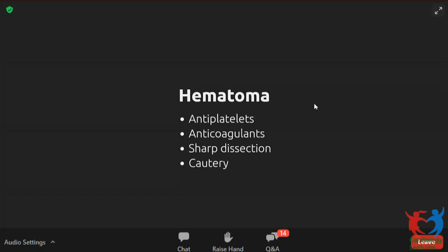Now, the first thing you should do is look at the electrogram. When you look at the electrogram without pacing, you see the intrinsic signal, and beyond the intrinsic signal, you see what looks like ST elevation. That is current of injury. This ST elevation is more prominent if you look at the unipolar. For unipolar, you connect the distal clip to the distal pin, but the proximal you connect to skin, then you get a unipolar recording.